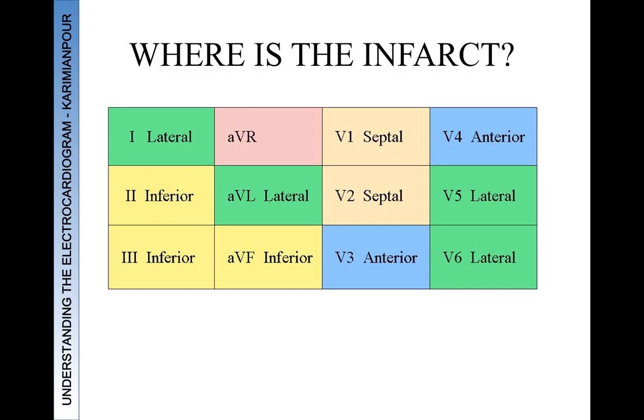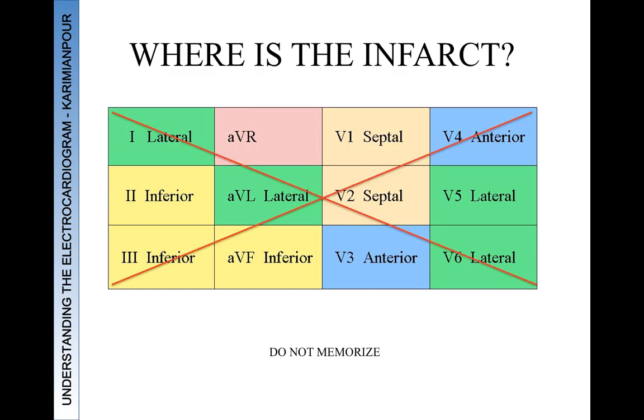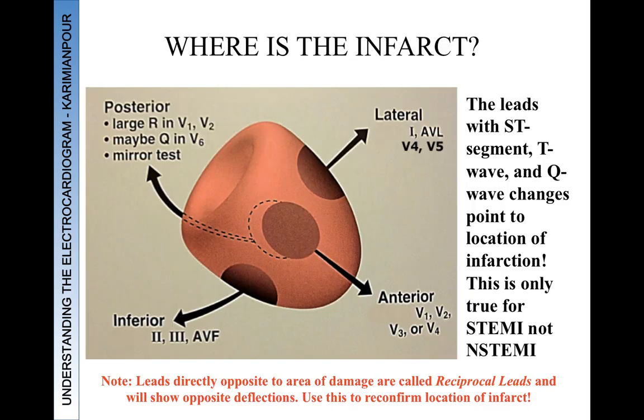And to be honest with you, I don't like to memorize, I like to conceptualize. So if we actually think about where the ST segment changes are in an ST segment elevation myocardial infarction, we don't ever have to memorize that chart. So let's go through that very quickly.